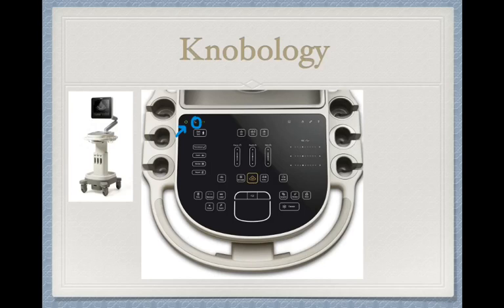It takes the machine like 2 or 3 minutes to actually warm up. So in general, we leave the machines on and then just put them in sleep mode. If you want to get started, you can push the start end button. That'll allow you to enter the patient information. We have barcode scanners, so you can just scan the patient's wristband. And then you put your last name into the last name section, so we know that it was you doing the scan.